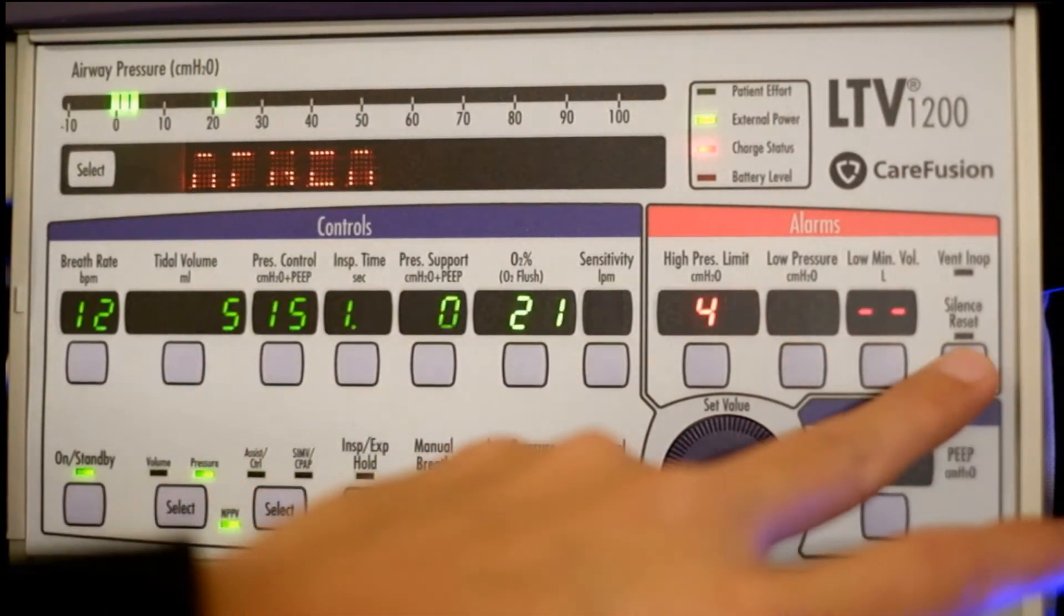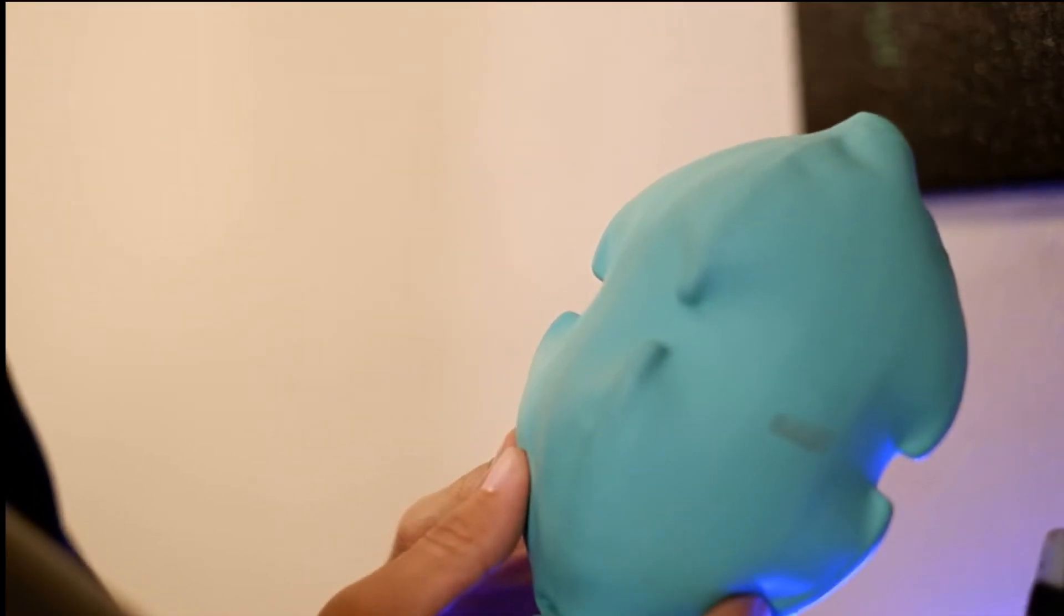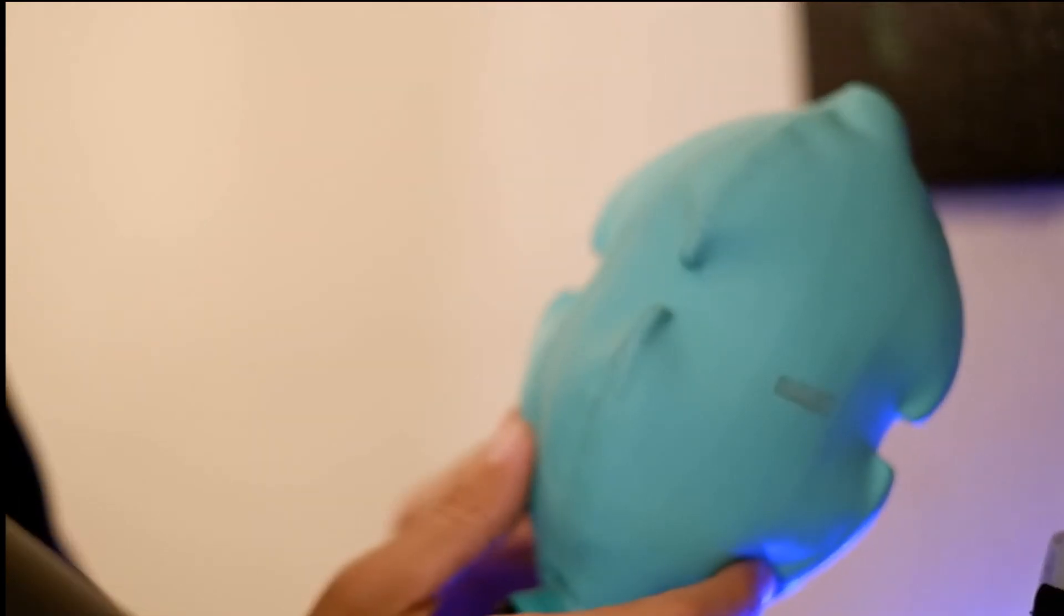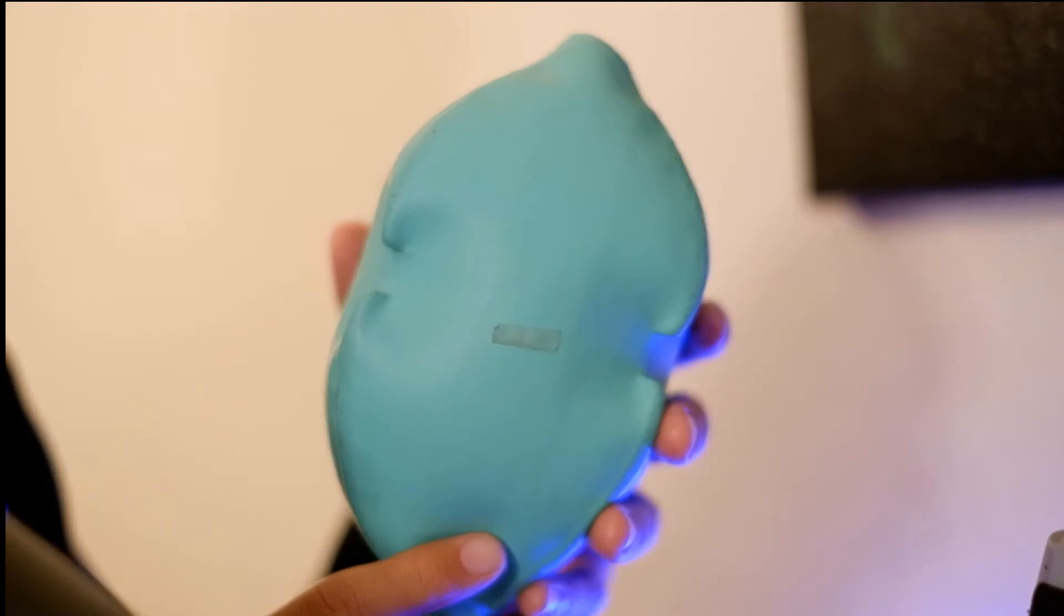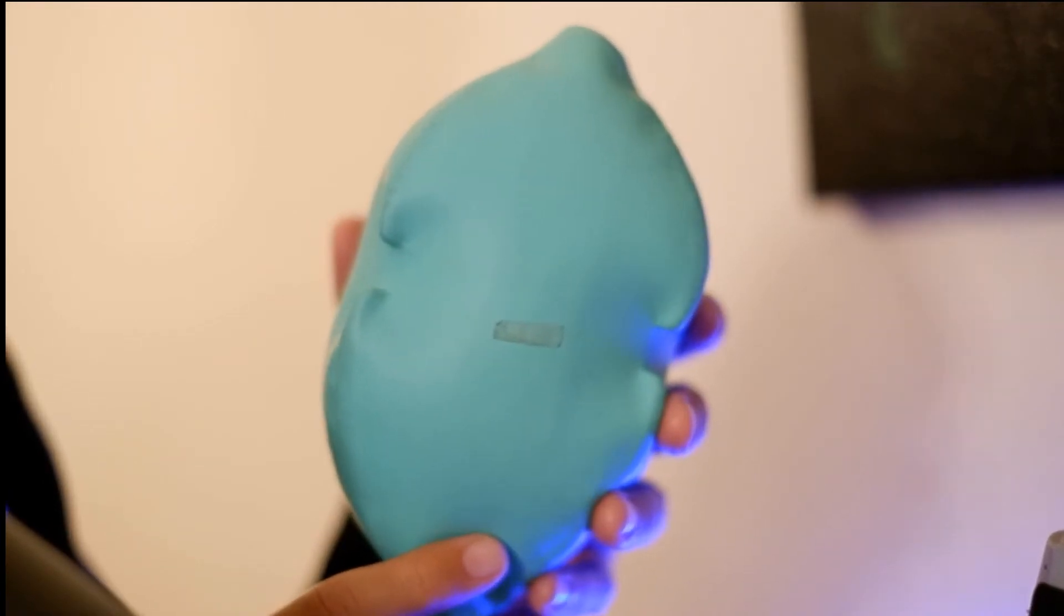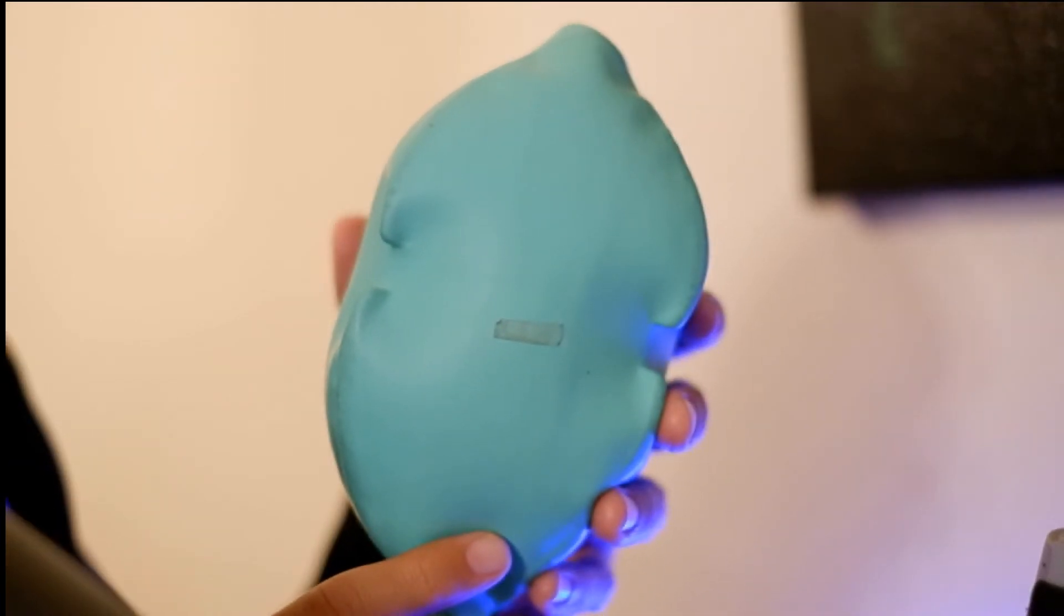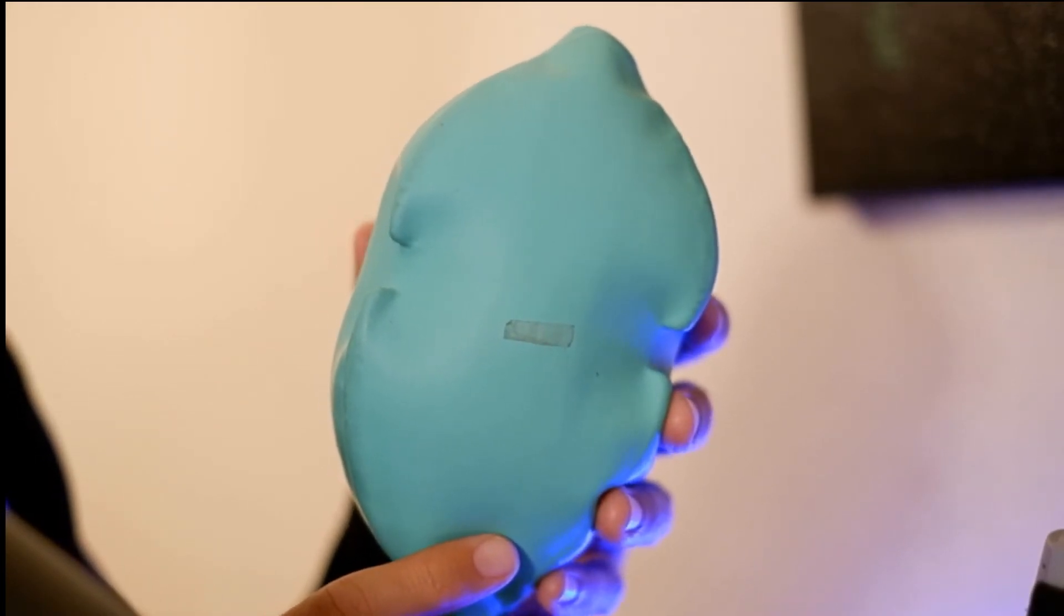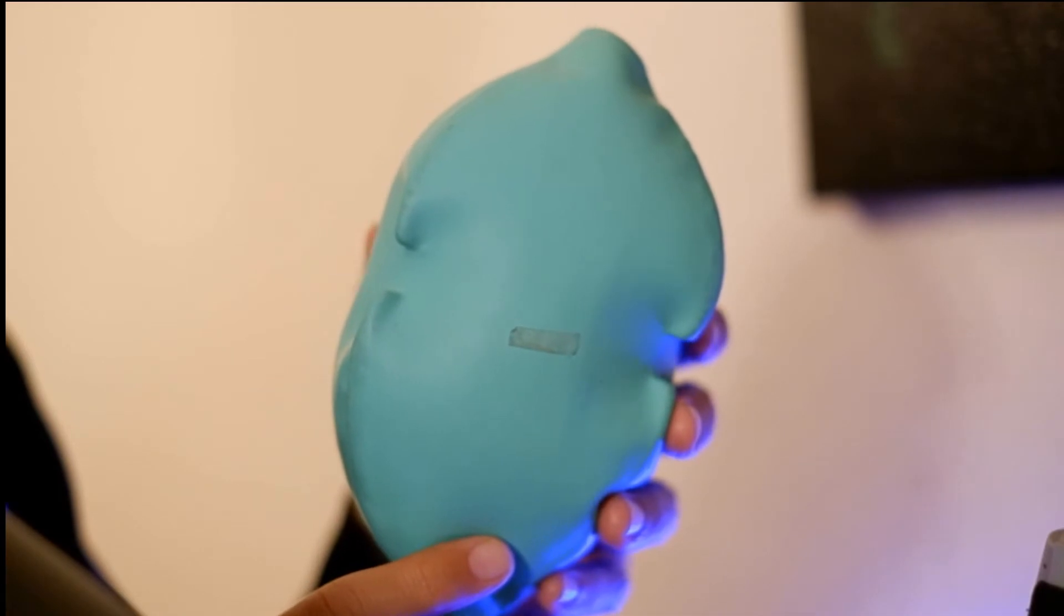Got an apnea alarm because it didn't sense breathing. So this balloon, this test lung, is kept open because of the PEEP. The pressure support comes into place when we take a breath. Watch. If you hear the machine, right now there's no noise, no effort from the machine, no pressure support because we didn't breathe. So when the patient breathes, it helps out with the breath.